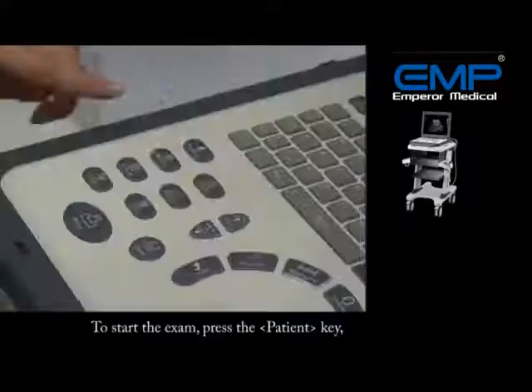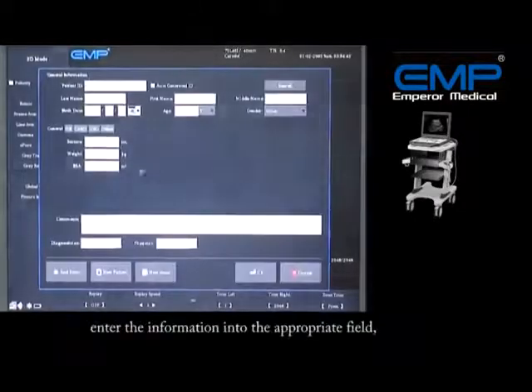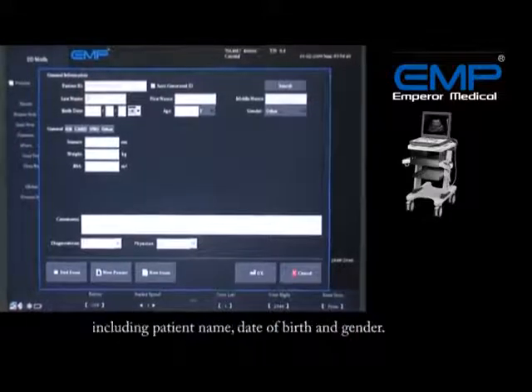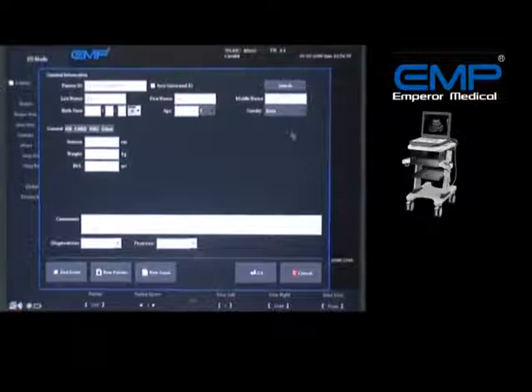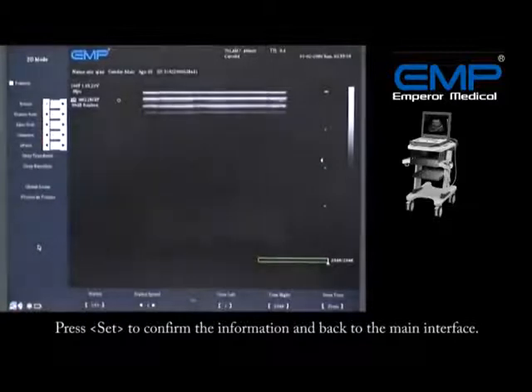To start the exam, press the Patient key. Enter the information into the appropriate fields, including patient name, date of birth, and gender. Press it to confirm the information, then return to the main interface.